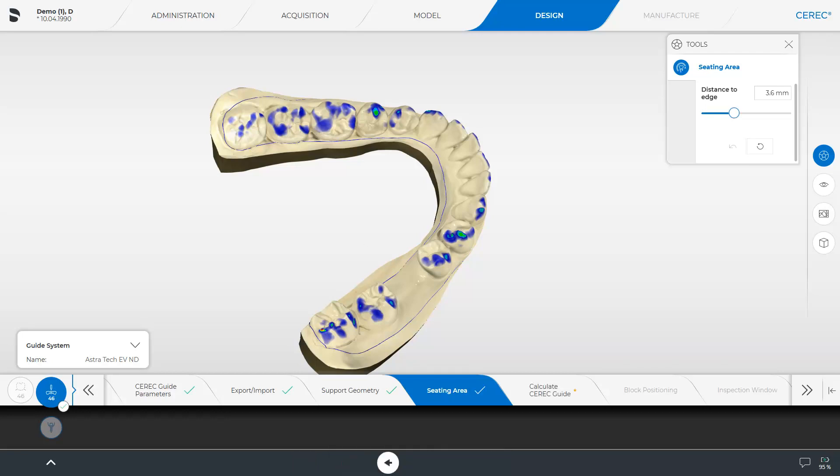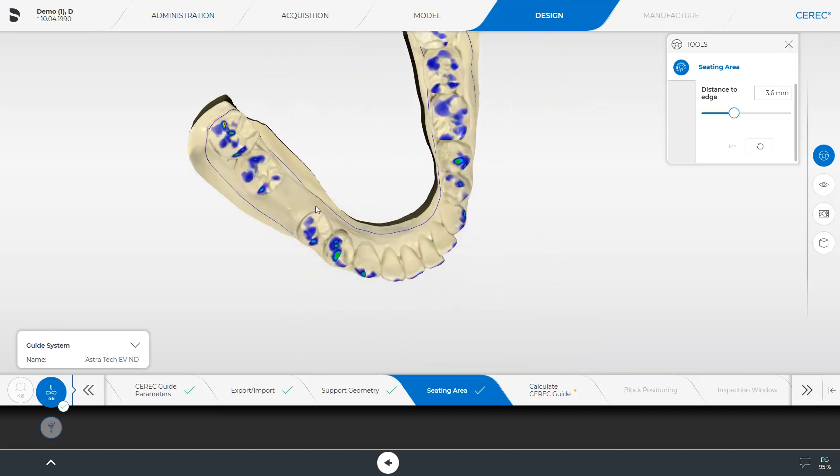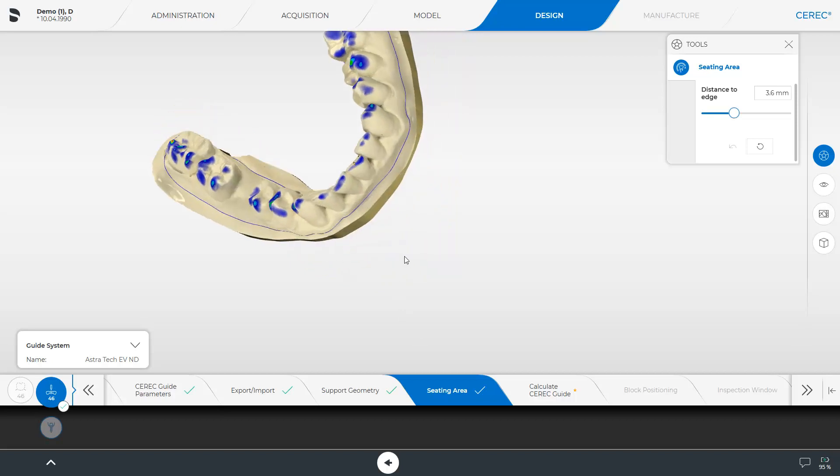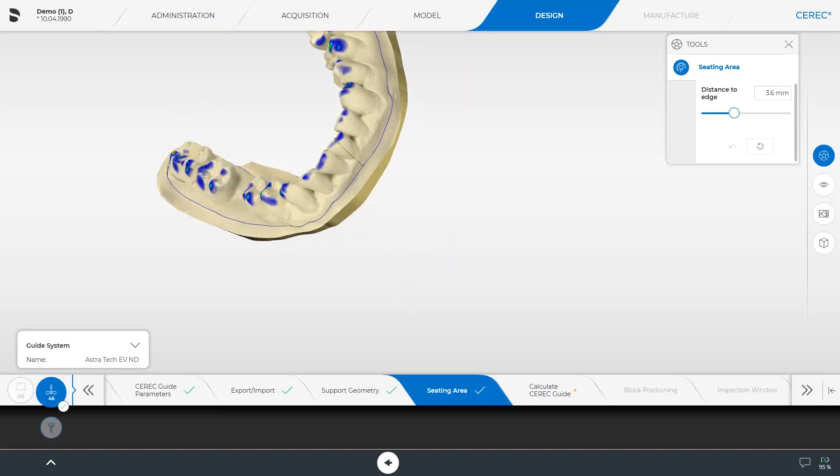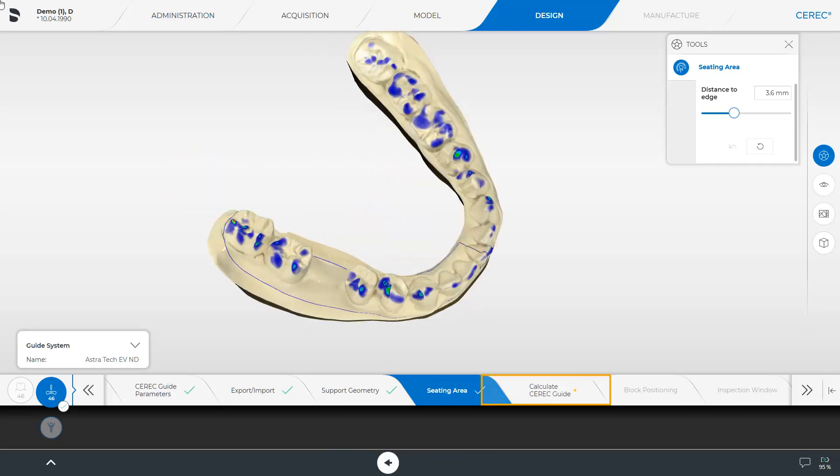Additionally, you can already shorten the guide or correct certain areas of the seating area in this step. This tool works in a similar way to, for example, correcting the preparation margin. Since we want to create the guide over just one quadrant, we reduce its application area. We move the cursor to the starting point of the modification and start by double-clicking on the blue line. By applying another single click, we extend the cutting edge to the vestibular until we can complete the corrected line with another double-click on the blue line. We confirm again with OK and click Calculate CEREC Guide.